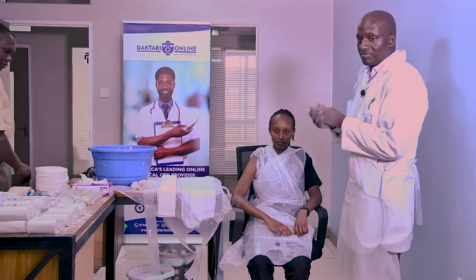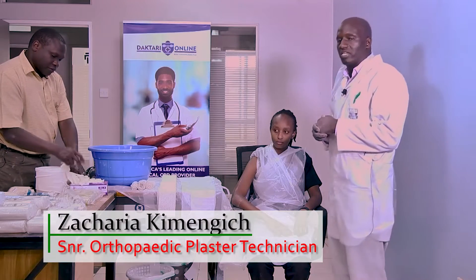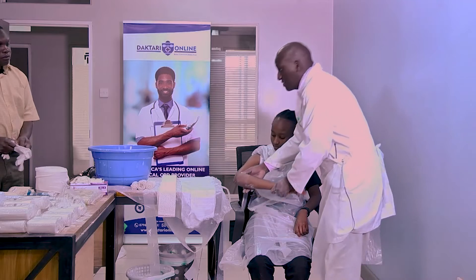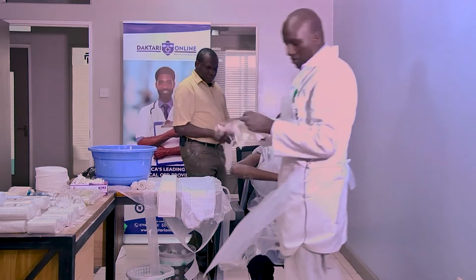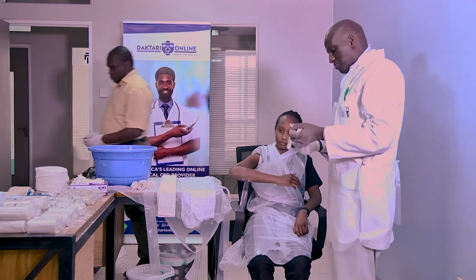So very importantly, for any procedure you are doing, you should already have explained to your patient what you intend to do. Then position the patient, and you need to have an assistant — this is very important. When you're doing any procedure, especially a fracture, you cannot do it alone. Having an assistant is very important to be able to hold.